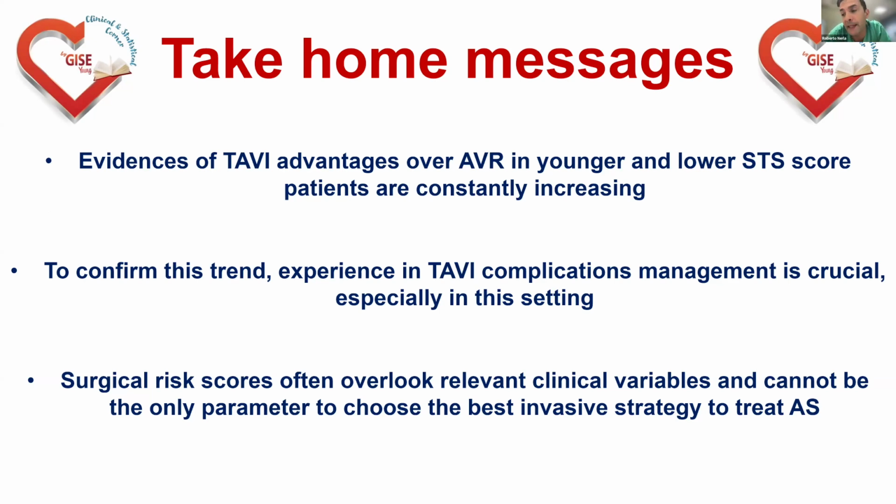So probably in the future, we will... I don't think we have to learn about sizing and about positioning, and you know perfectly, as Giuseppe showed many times. So we are probably waiting for novel platforms that could help on that. So maybe changing the adaptive seals and also the radial force of the devices. But still we are behind the surgeons.